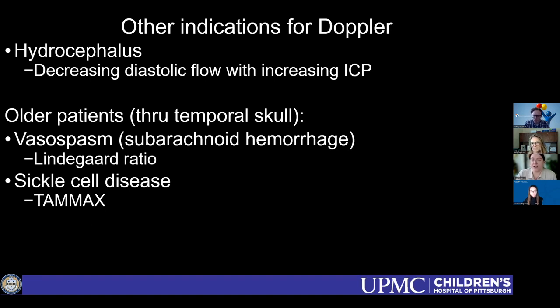At CHOA, it's been a really interesting process though, because we're one of the biggest sickle cell centers in the country. It's Atlanta. We do more sickle cell TCDs than probably anybody else in the country. We're doing upwards of 20 of them a day, most days. But we have the old school Doppler for that. So we don't get imaging. We do not do visual TCDs. We just get the waveforms.